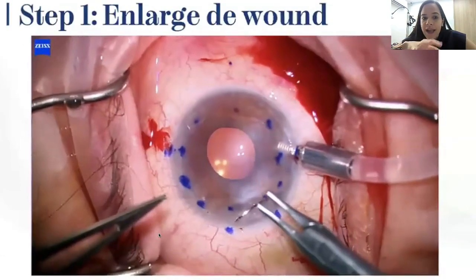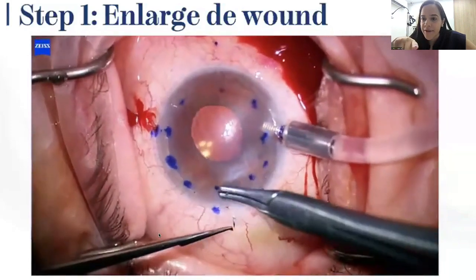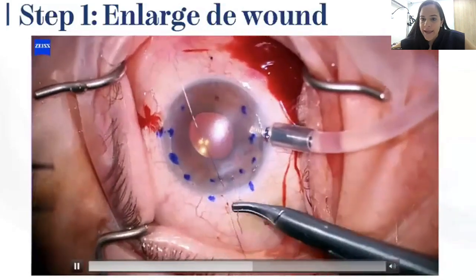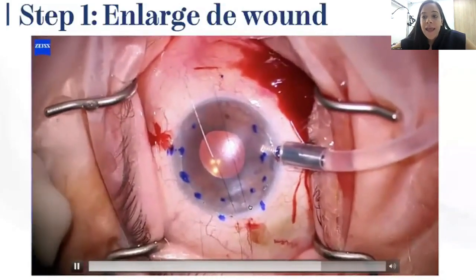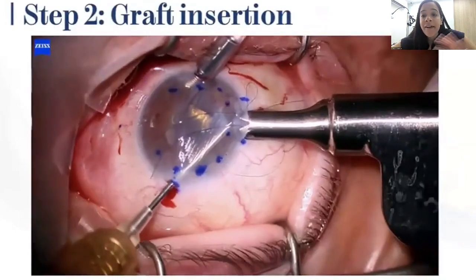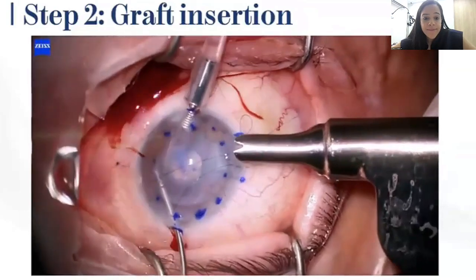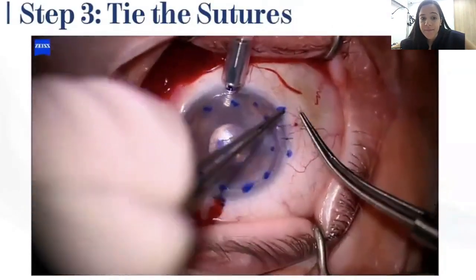In our surgery, after doing our descemetorrhexis, we enlarge our wound to between 4 and 5 millimeters, and we insert our AC maintainer inferiorly, like in the DMEK. Then we put 2 sutures in the main incision that we will tie after we insert our graft, to protect the graft from going forward. After that, carefully, we insert our graft into the appropriate position, and then we tie our sutures.